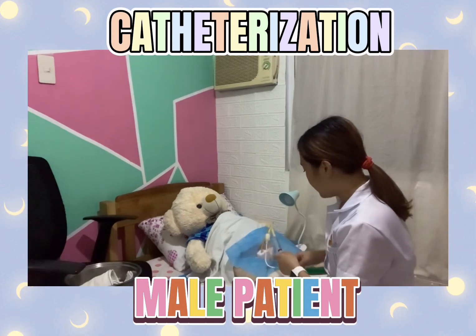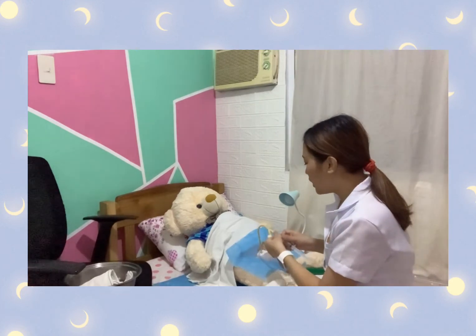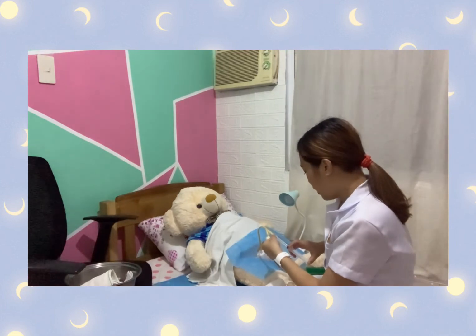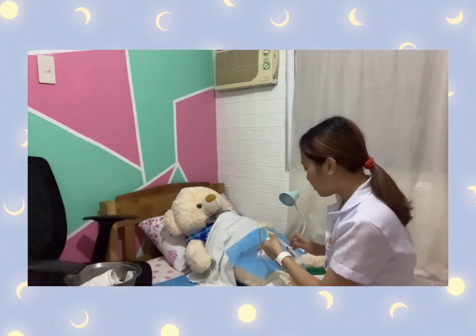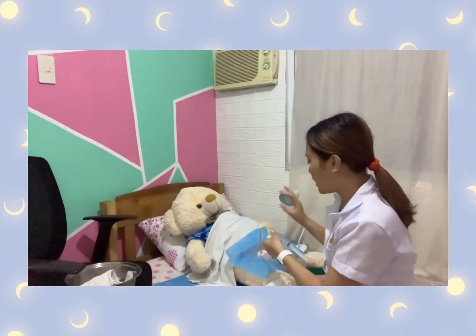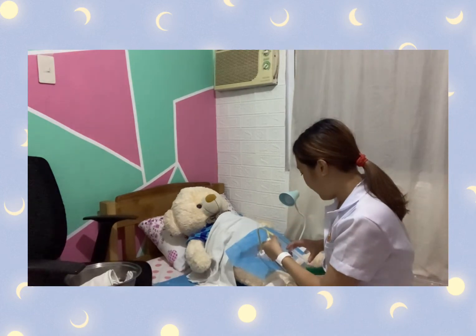After that, since we are using an indwelling Foley catheter, we need now to inflate the balloon. So, we will put the approximate amount from the pre-filled syringe onto the balloon, depending on the manufacturer's label. Here, we will use 15 ml, or 5 ml rather.